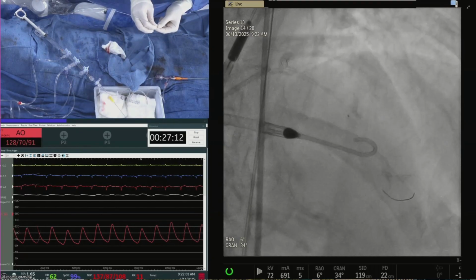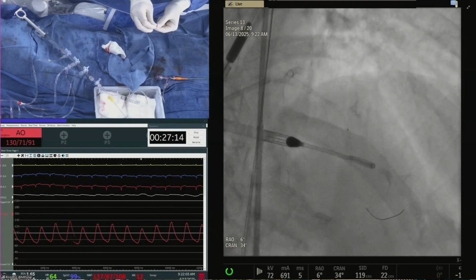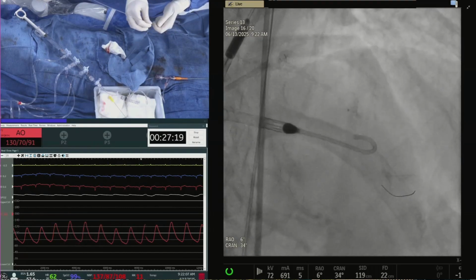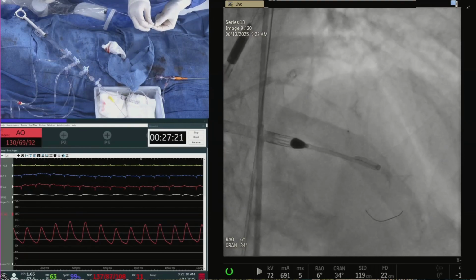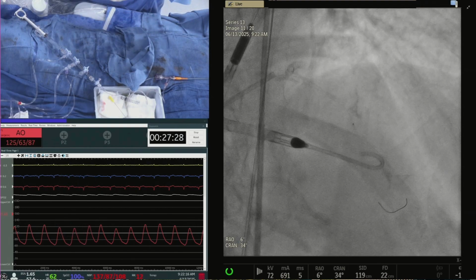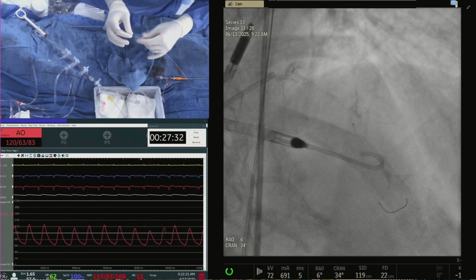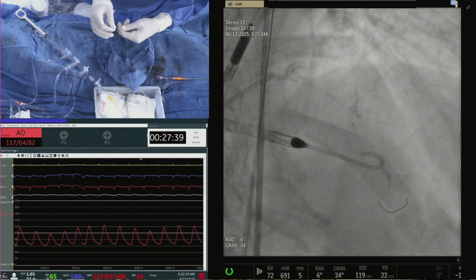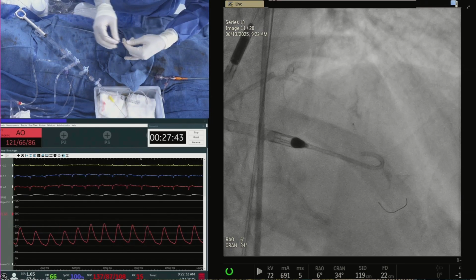I just wonder, we have Bruno Scheller and Jazz. I know Jazz uses a lot of adjunct devices, but you're both also quite excited about drug-coated balloons. Would you consider a drug-coated balloon to this diagonal and then do the rest of the work down the LAD? Or are you open to how Dr. Kinney is proceeding? Because she's going right in with a rotational atherectomy. So why don't we start with you, Bruno, and then I'll ask Jazz.